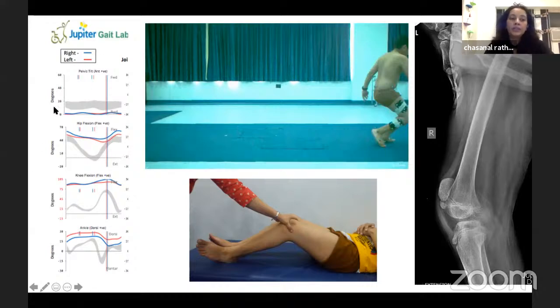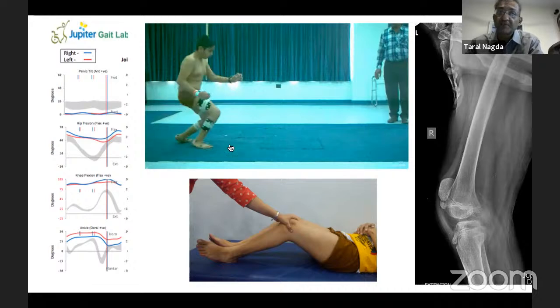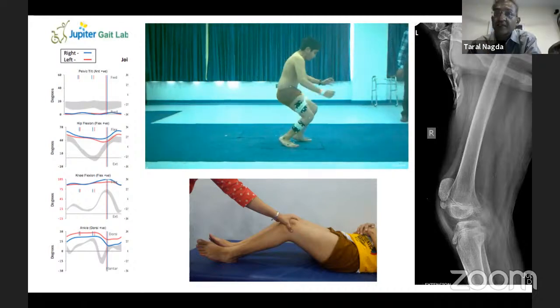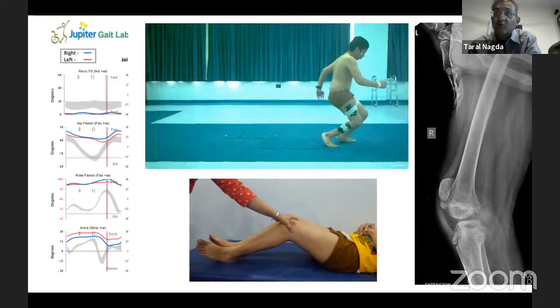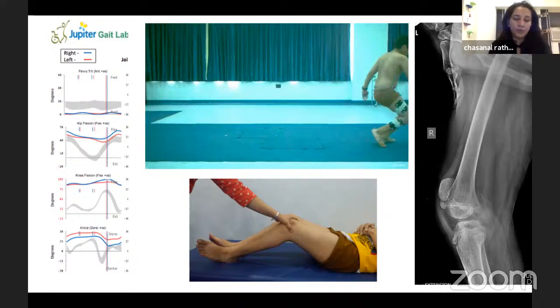So looking at all this, this is something which is a big value of gait analysis, because it prevents you from doing an unnecessary calf lengthening. Then this child will stop walking. The option is worse. Yes, totally agree. Absolutely.